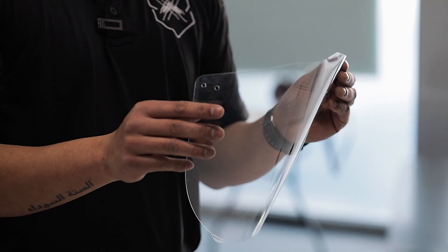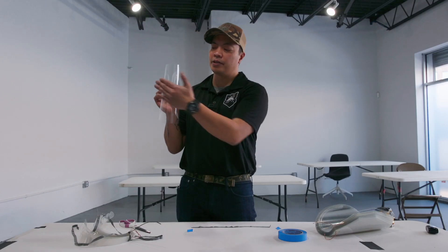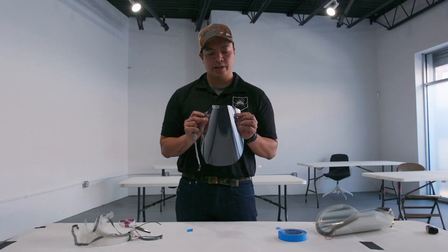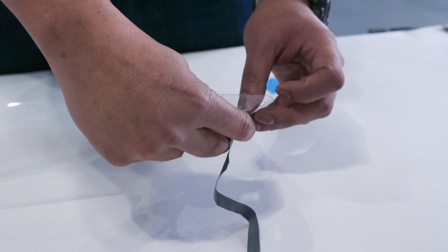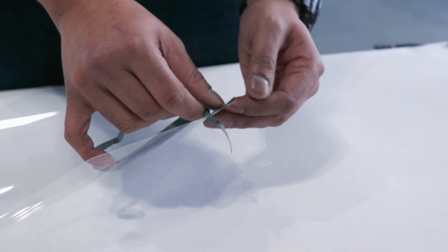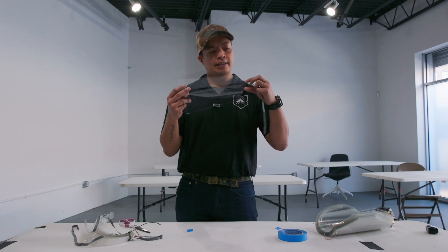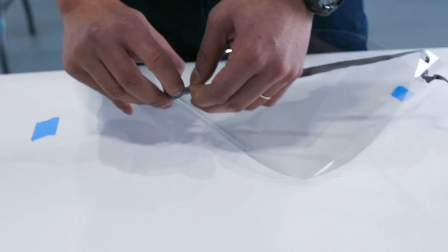Next we're going to take the face shield. There's going to be two sets of holes on each side. You're going to put it on each side like this — this is going to be the outside of the face shield. The first thing you're going to do is take your elastic and put a big knot on one end. We'll start with the left side of the mask as you're wearing it. On the second hole, the one closest towards the front, we're just going to slip it in through the front. Then from here we're going to wrap it back around and go through the first hole closest to the edge.